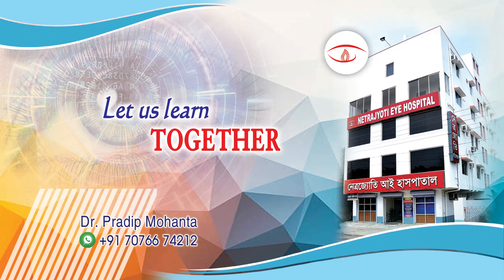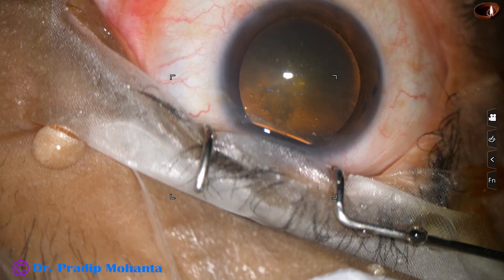Friends, welcome to my workplace at Ranaghat, West Bengal, India. This is a posterior subcapsular cataract. Let us observe the management of this case.